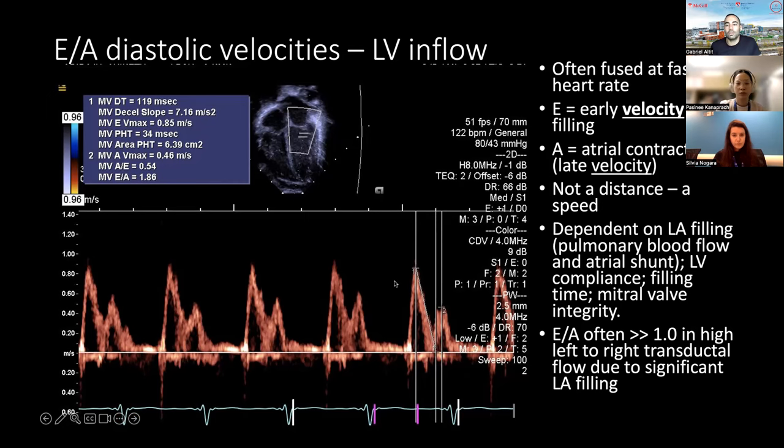And you would expect it in ventricles that are very, very compliant. So in normal diastolic conditions, you would expect a ratio of E on A to be above one. But babies, especially those that are premature, in the first few days of life, typically their ventricle is still very stiff. Typically their ventricle muscle is still very predominant because of the fetal physiology. And so it takes a bit of time for this ventricle to remodel. So that's why in the first few days of life, in babies that are preemies and they have a very tiny PDA, often you'll get a low E wave and a fast A wave. And so this ratio is less than one, unless you have a big PDA. So that's why some of the PDA scoring systems tell you you get a ratio above one. Now with time, this changes, right?